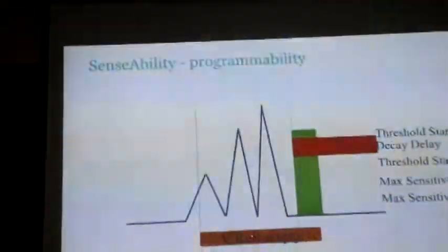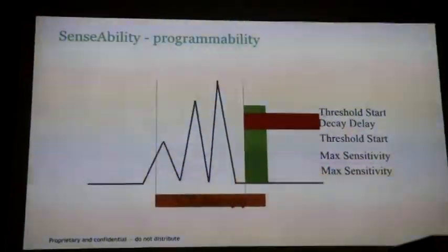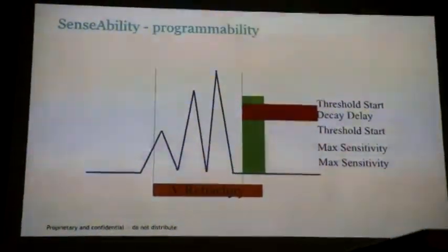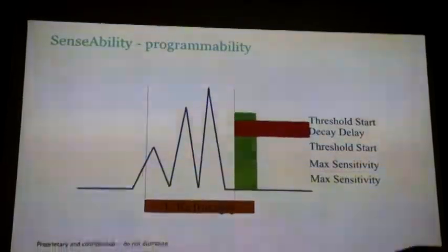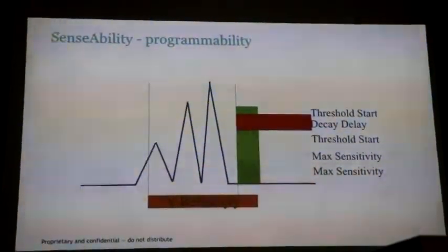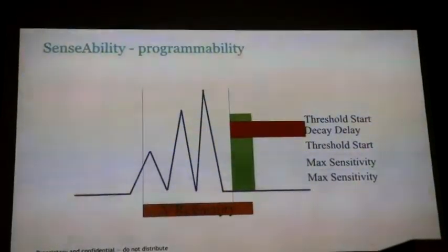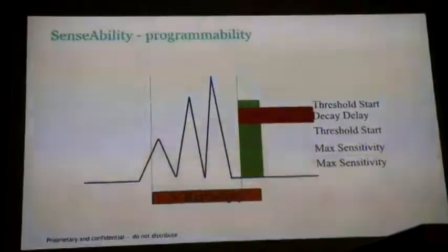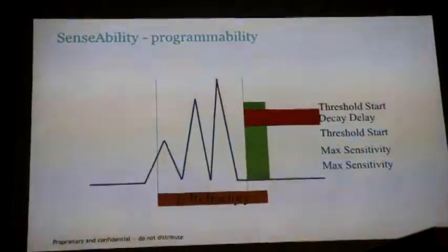So this here, you might change this here. Max sensitivity, you sometimes might use if you've got T-wave oversensing, but in our device, not normally. This we would normally change if you're sensing diaphragm. You can sense diaphragmatic signals with ICDs. Anyone seen it? No. Okay, I'll show you. You've seen it. I'll show you it later as well. We've got a couple of nice cases.